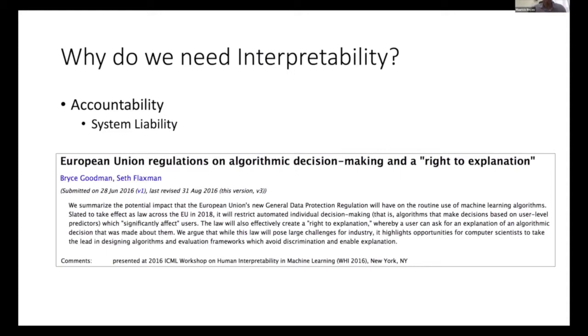A concrete example would be a patient who was diagnosed with cancer, fully automated. The report was generated by the system, and this is what is then used. That machine learning system needs to provide an explanation as to why that patient was diagnosed with cancer. Now, we could come with a probability saying there is a 90% chance the system predicted that this patient might develop cancer.